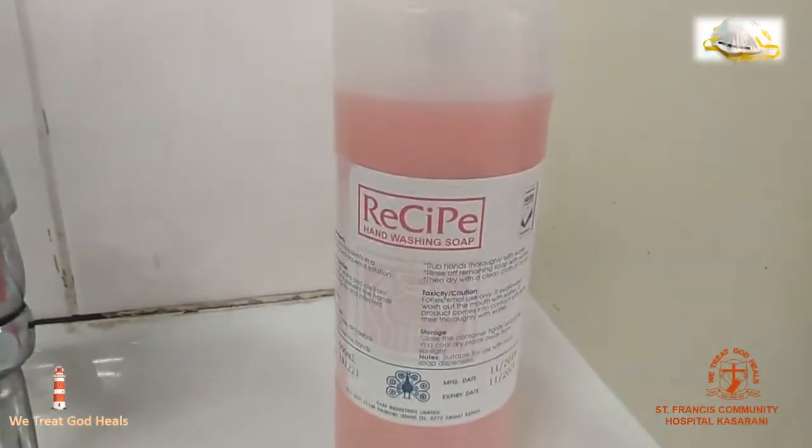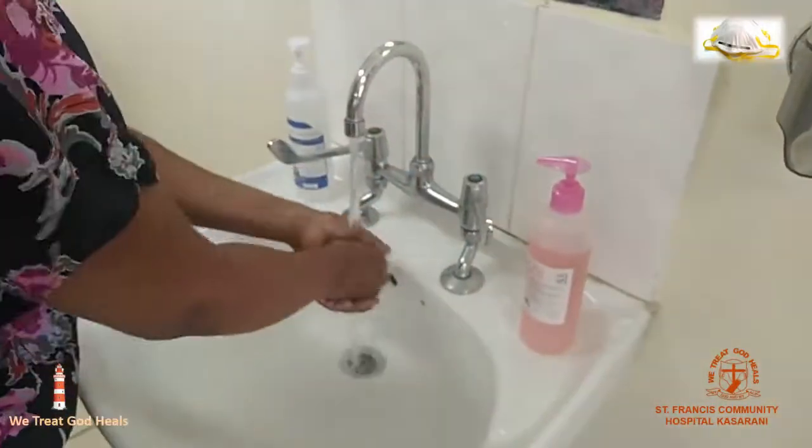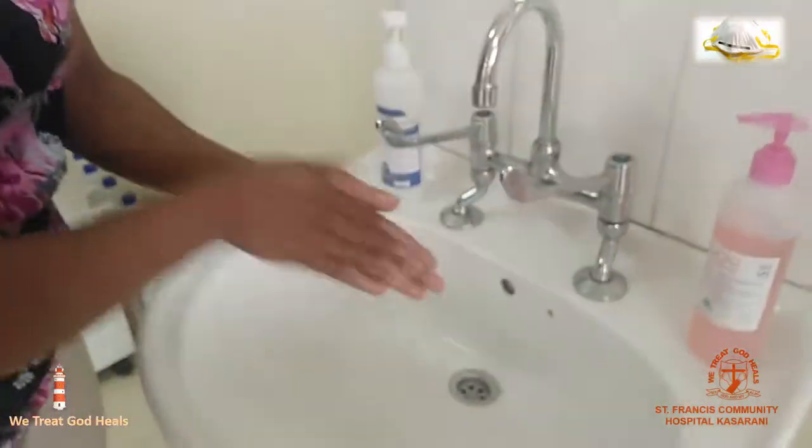The first step is to wash your hands with running water and soap, or sanitize with an alcohol-based sanitizer before putting on or donning the mask.